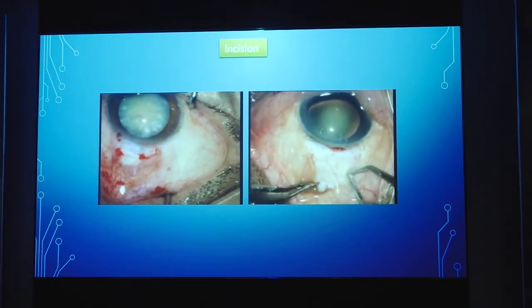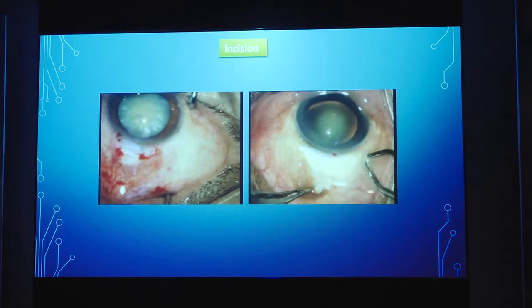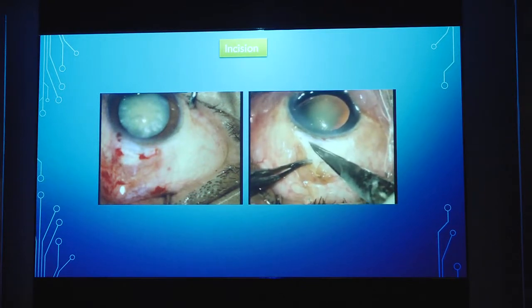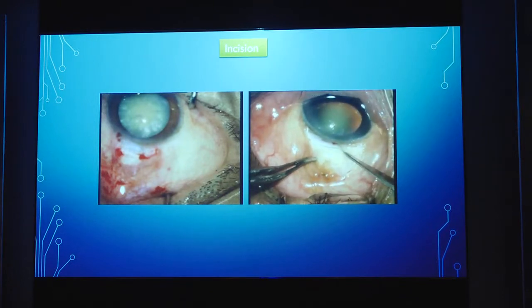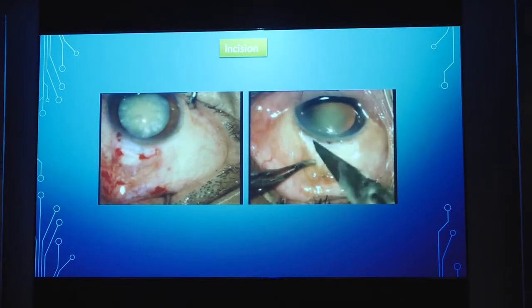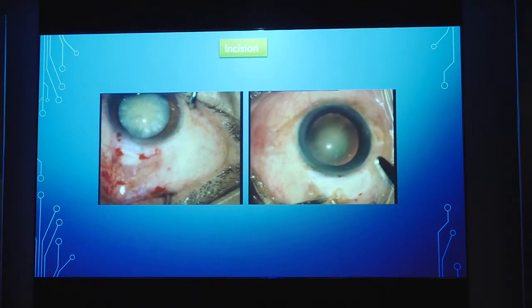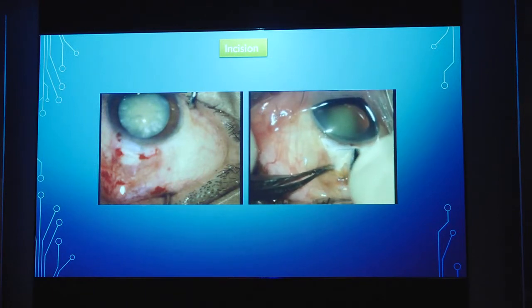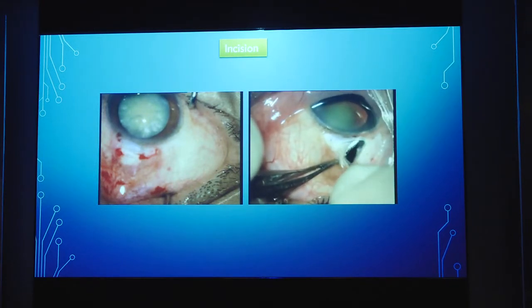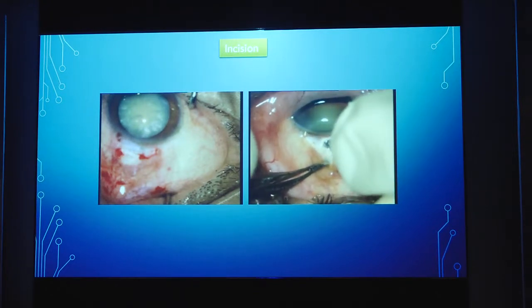And cautery. Not too much cautery, but not too little cautery is extremely important. If too much cautery is used, then the sclera will be affected and it will affect your healing. So incision 1.5 millimeters behind the limbus and a modified frown incision. Now dissection in the mid sclera, and here there is no cutting. It is just separation of the collagenous layers of the sclera.